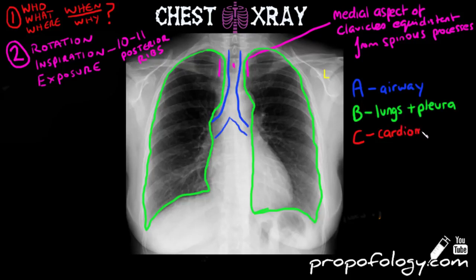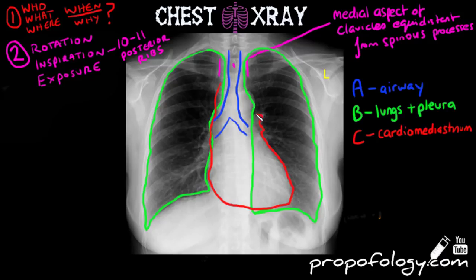For C, you're going to be looking at circulation or the cardiomediastinum. You're going to try to trace the outline of the heart — look at the right side first, tracing round the apex and then the aortic knuckle at the end. You're looking for an enlarged heart or a widened mediastinum.